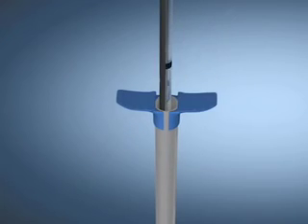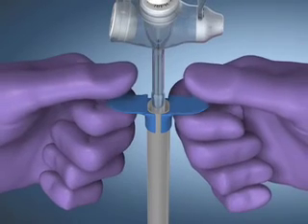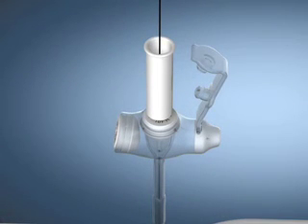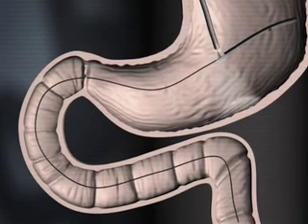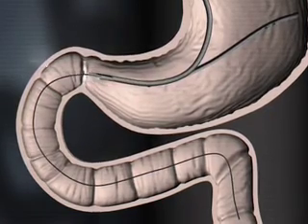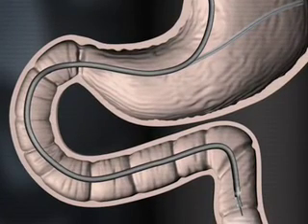Advance the tube over the guide wire until the proximal end of the guide wire exits the introducer cannula. Peel the sheath down to skin level. Hold the introducer hub and jejunal feeding port while advancing the tube into the stomach. After the tube has been advanced through the peel-away sheath and is in position in the stomach, peel the sheath away from the tube. Using endoscopic guidance, grasp the suture loop or the tip of the tube with atraumatic forceps. Advance the tube through the pylorus and upper duodenum. Continue to advance the tube using the forceps until the tip is positioned 10 to 15 centimeters beyond the ligament of Treitz and the balloon is in the stomach.